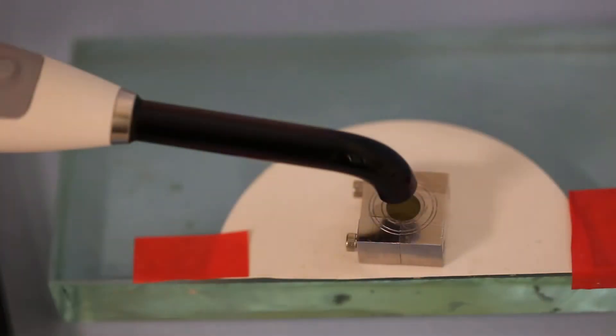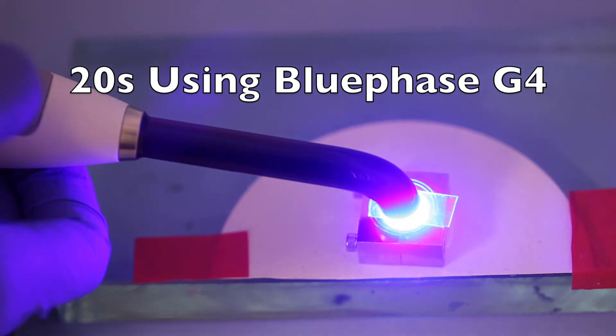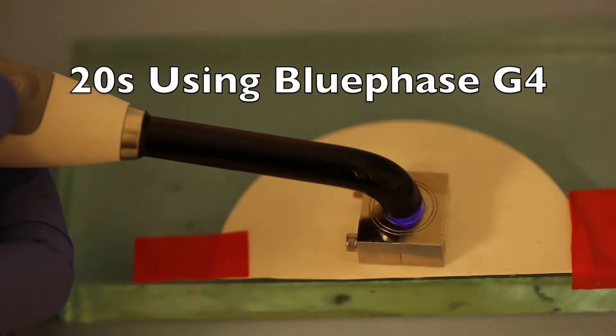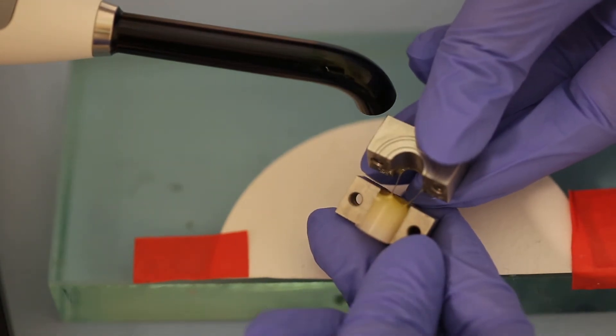Now we'll cure it for 20 seconds with the Blueface G4. And if you thought 10 seconds was long, how about 20 seconds using the G4? This seems like an eternity compared to the 1 second with the Monet. Let's see what the composite looks like. Although we had to cure it for 20 seconds, the bottom was more cured. We'll dissolve away the uncured composite.